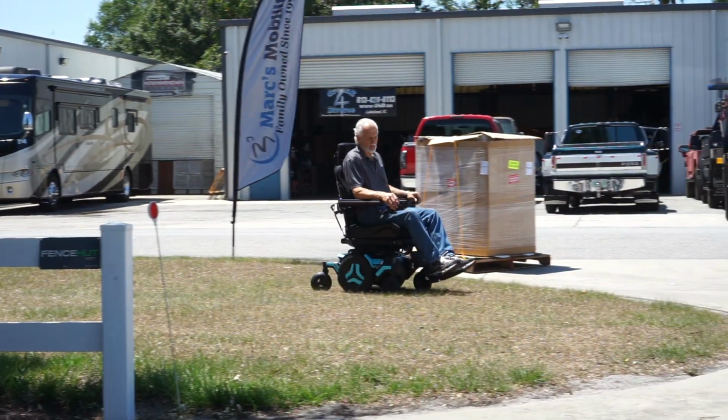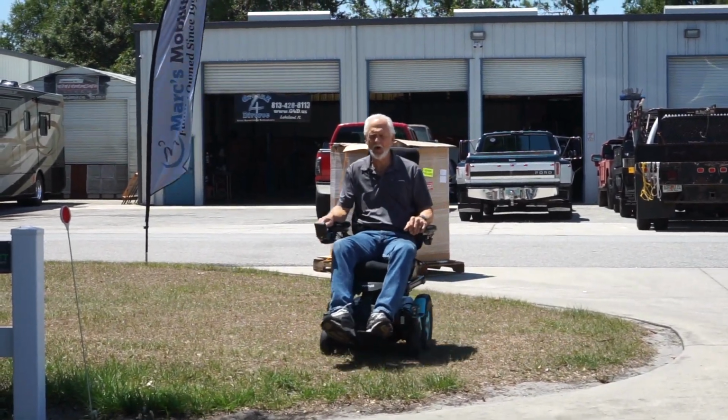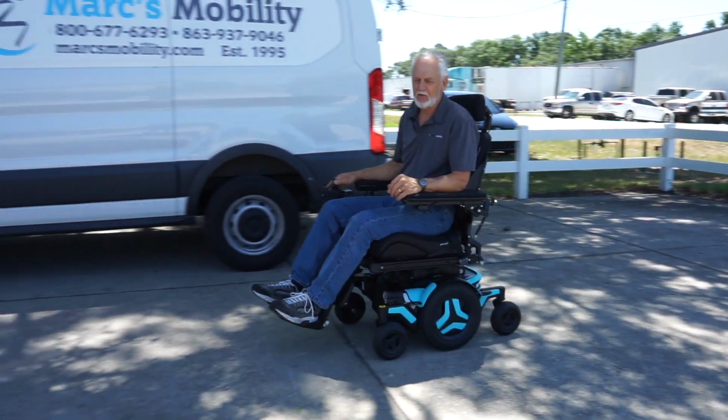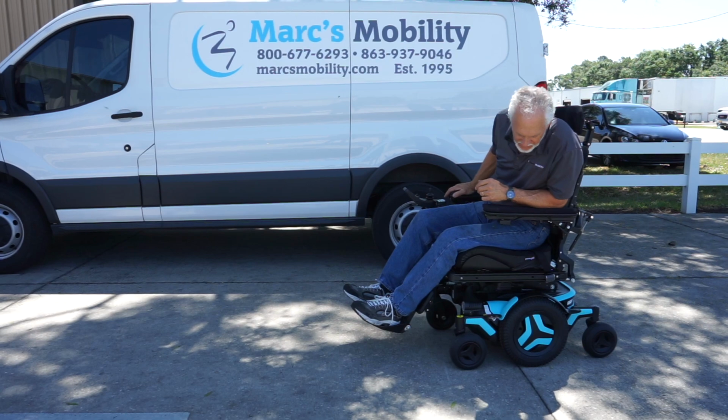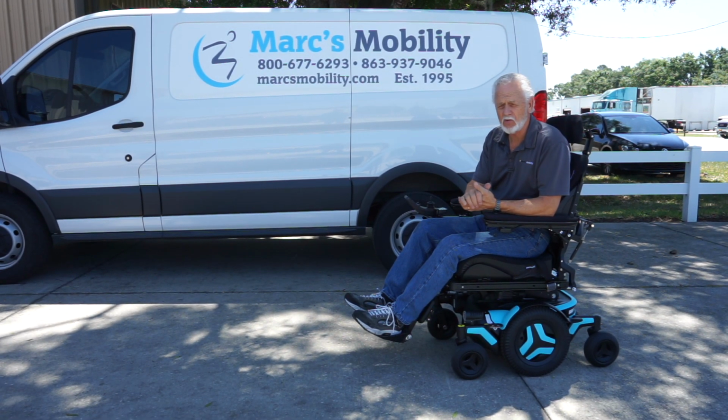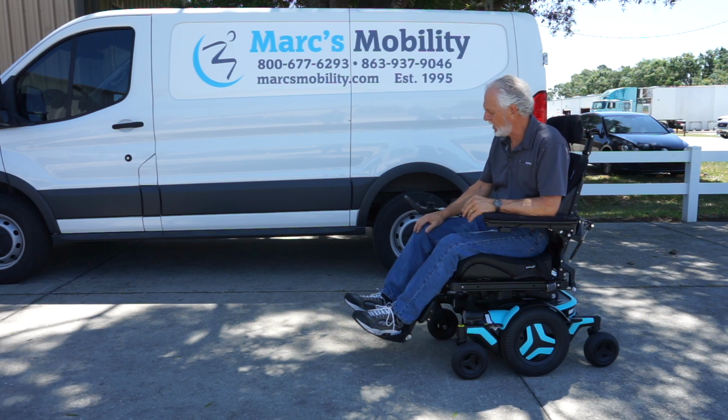And there's no problem in the grass, because right now we don't have a lot of grass. It's kind of winter here, or I should say spring. So this is the M3 power chair. If you're going to ride it in the grass, as long as you have a good bottom in your grass, it's not sandy, you should have no problem at all.